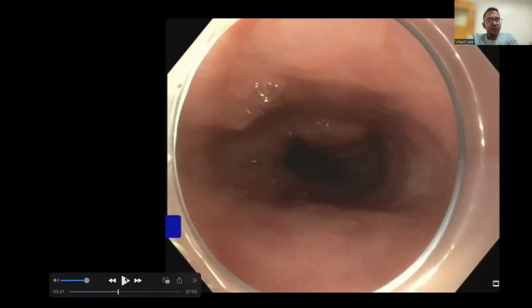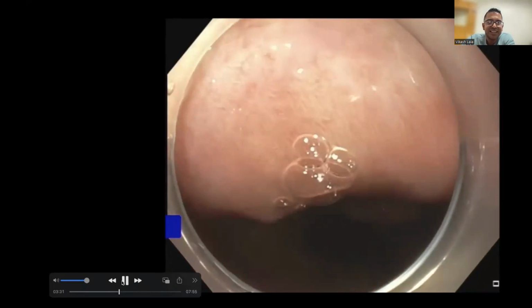So then if you pull that scope a little bit back, there's something else going on here. And here's where your blink impression tells you again. So there's two obvious nodules, which are cancer. But there's something more subtle happening there. Okay. You get the impression that there might just be a little bit more bulkiness there. So what you want to then do is take a closer look again.